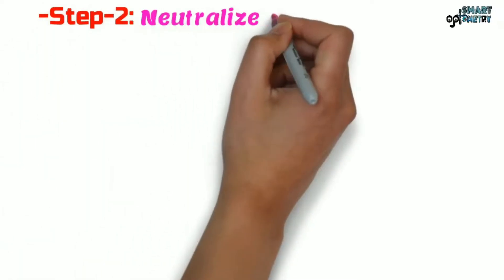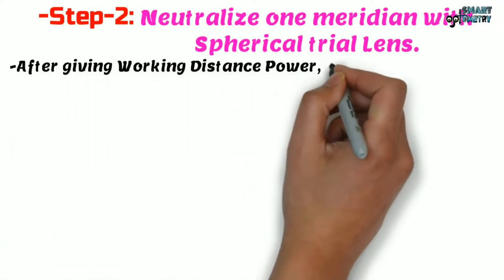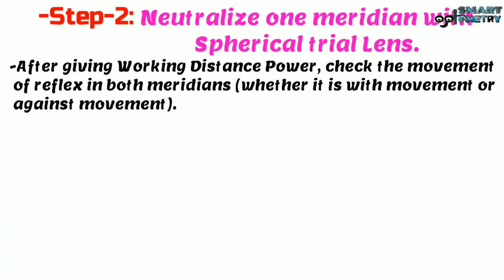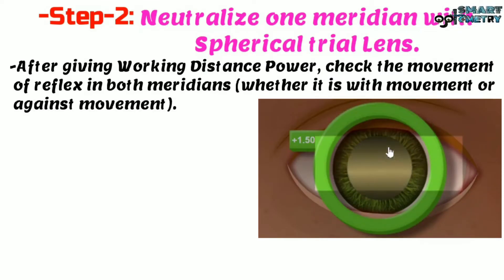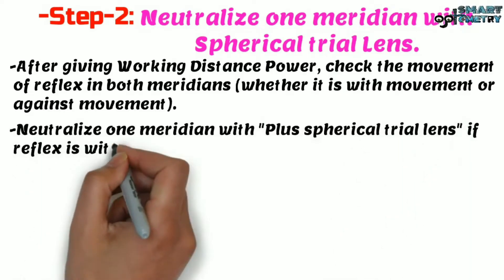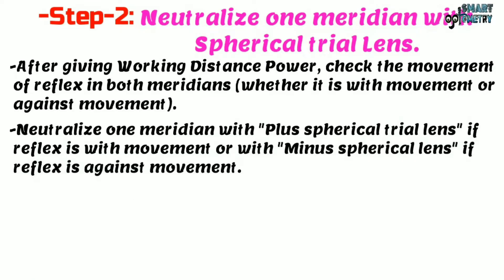Step 2: Neutralize one meridian with spherical trial lens. After giving working distance power, check the movement of reflex in both meridians — whether it is with movement or against movement. For this patient, after giving the working distance power, we can see in both meridians the movement is against movement. Neutralize one meridian with plus spherical trial lens if reflex is with movement, or with minus spherical trial lens if reflex is against movement.